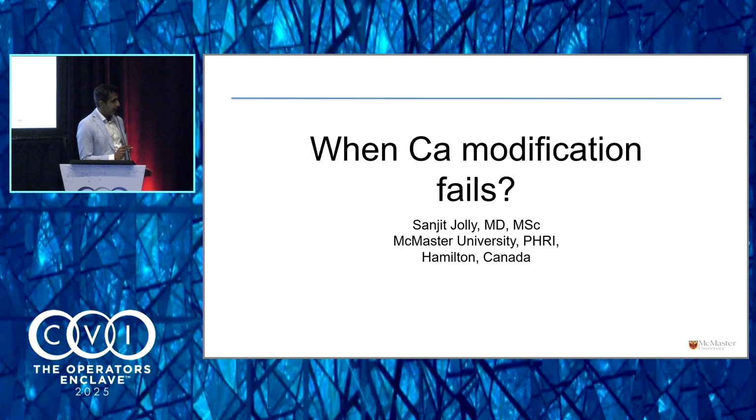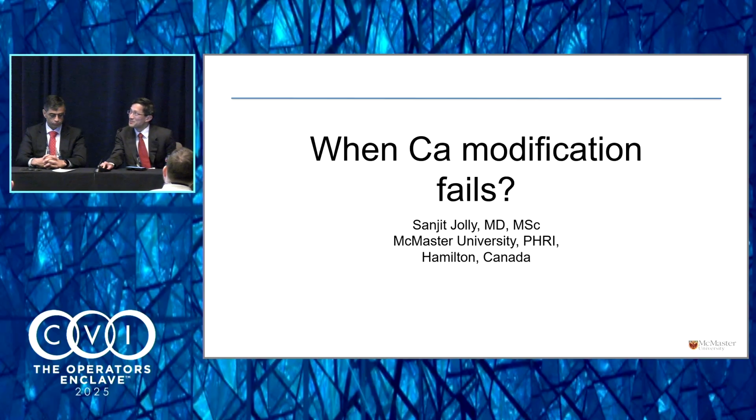So I think it has to be used carefully, and we always think that this doesn't require any training. What I would say is that we image these cases and we specifically undersize. Occasionally we'll go one-to-one, but for the most part we undersize, and you get excellent areas with this technology. Specific to the calcified nodule, one might think that that could be at risk of perforating because you're dilating in one direction.